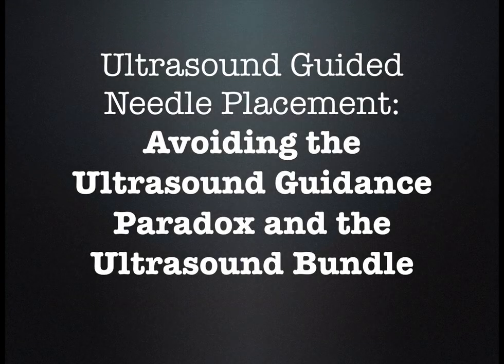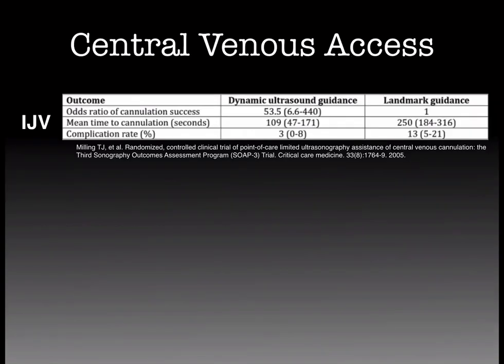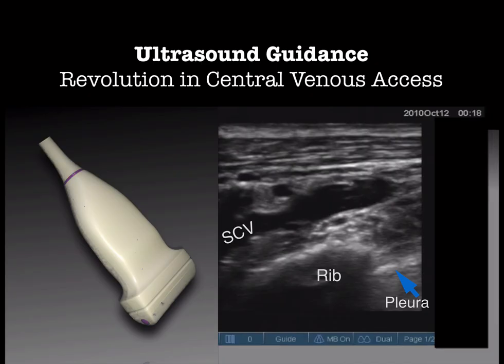Let's talk about ultrasound-guided needle placement. All right, so we all know that with ultrasound, if you read the literature, ultrasound decreases the complications from central lines. And it really doesn't matter which site you're looking at, you will find a decrease in the complication rate when you use dynamic ultrasound, or watching the needle go into the vessel. And this only makes sense.